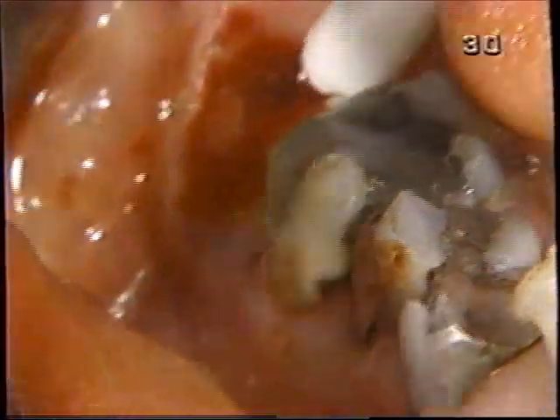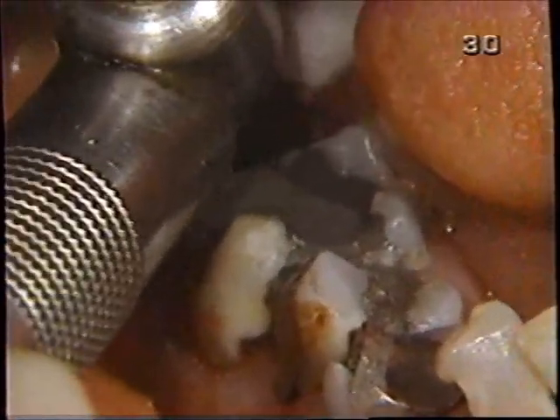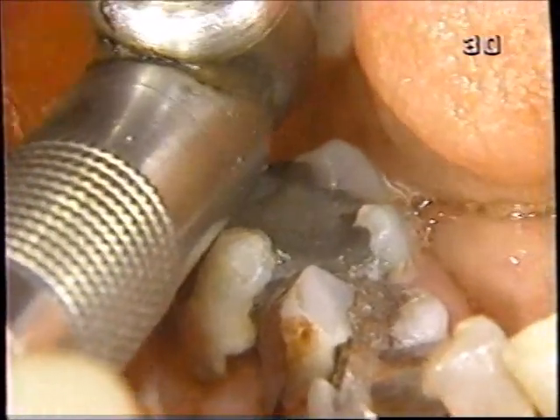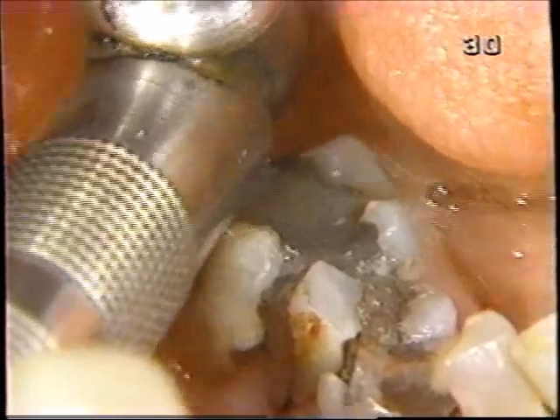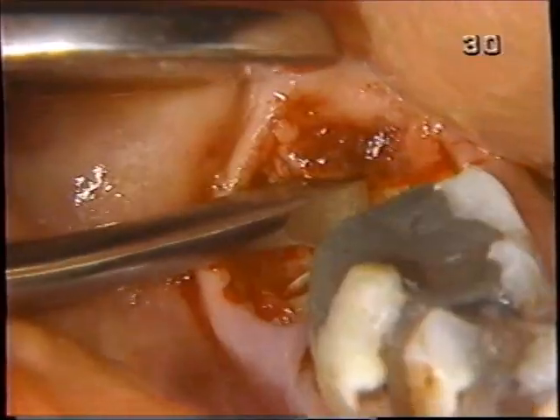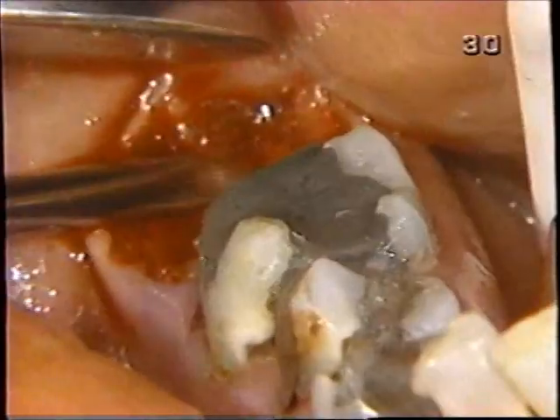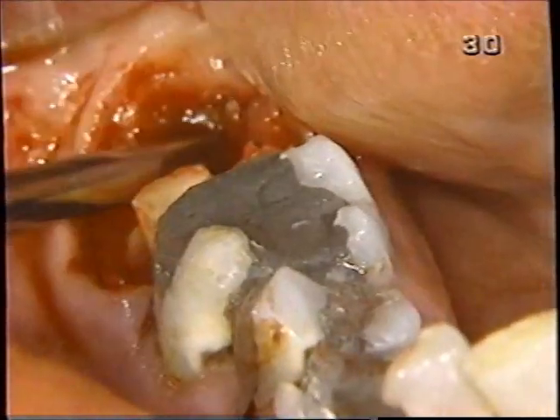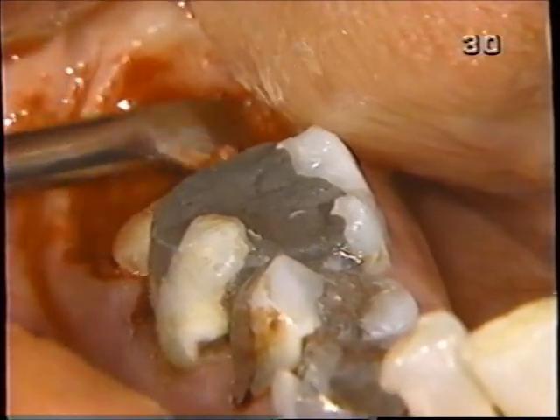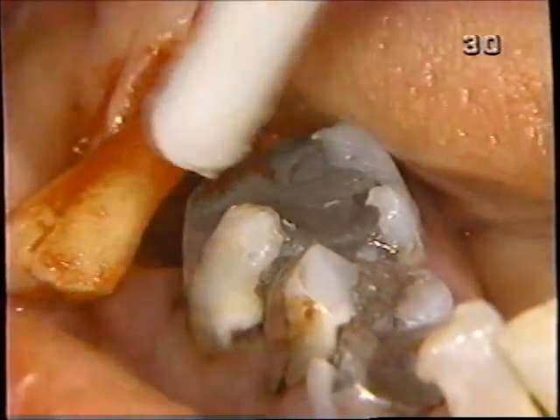I'm going to remove some distal bone here to get a point to insert an elevator, so that I'm not only trying to get it from the mesial aspect, but from the distal aspect as well. And using distal bone as a fulcrum, we're going to work on this coming from the posterior. There it is. We removed some bone on the distal to enable us to engage the opposite Cryer from the distal aspect in the distal surface of the distal root, and here it is. So go ahead and suction that out if you would.